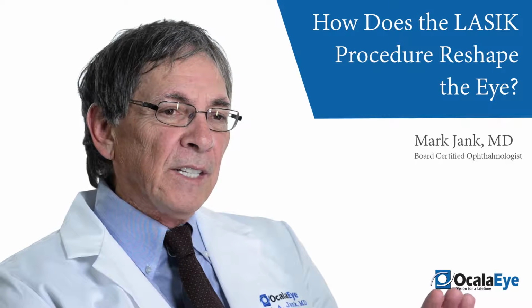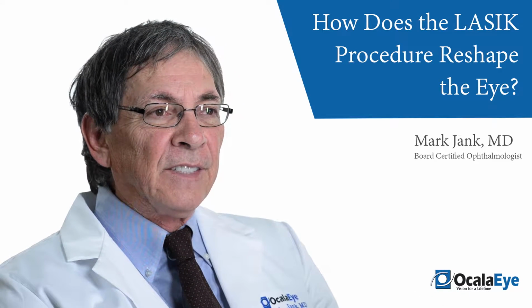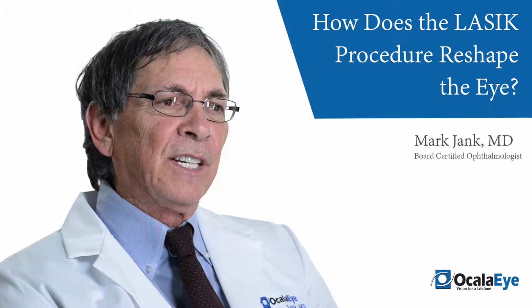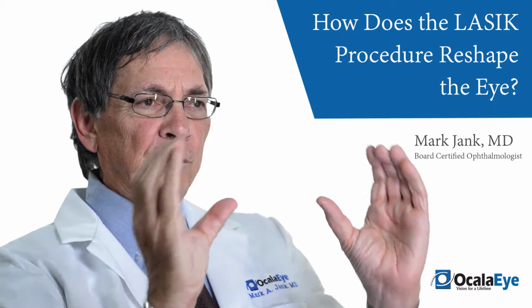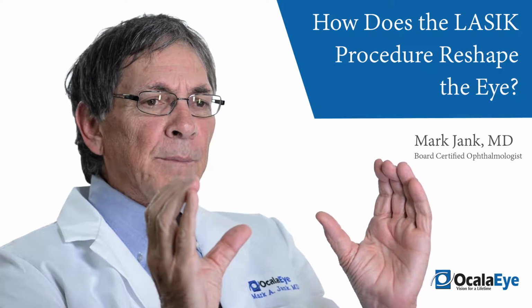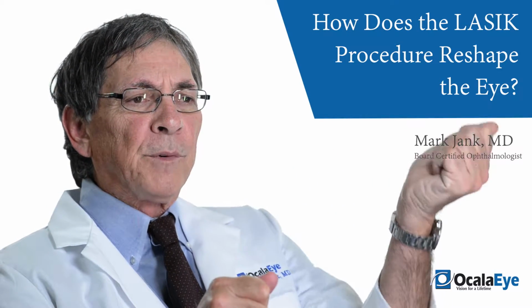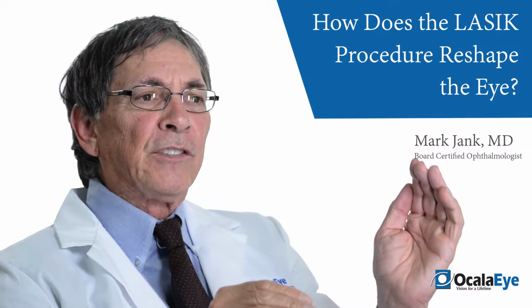So the cornea curvature needs to be changed. The cornea has thickness, and it's about 500 to 600 microns thick. But by analogy, let's say it was a telephone book. Let's say we had a telephone book here that was too curved and too steep, and we wanted to flatten it. By analogy, in LASIK, what we're going to do to the phone book is we're going to open the phone book up to about page 120. And that's the creation of the flap.